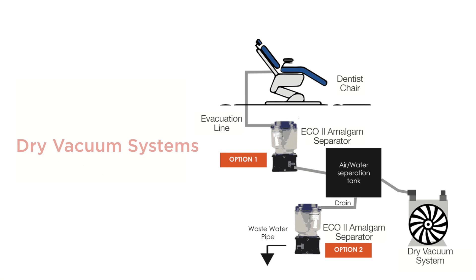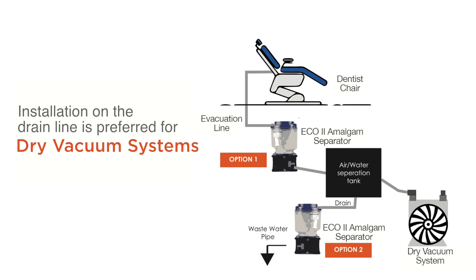For dry vacuum systems, the Eco2 can be installed before the pump or after the air water separation tank on the drain line. Installing the Eco2 on the drain line is preferred for dry vacuum systems.